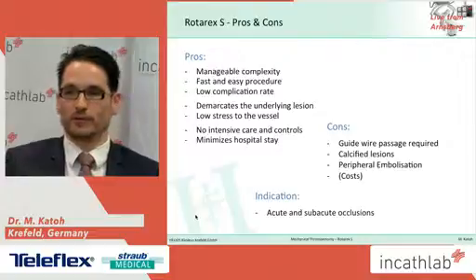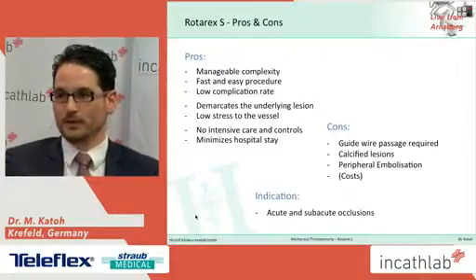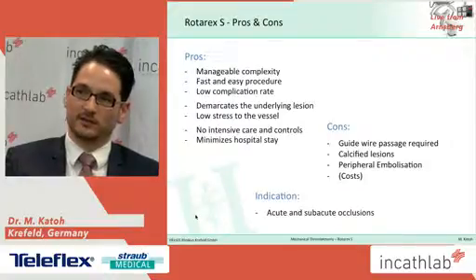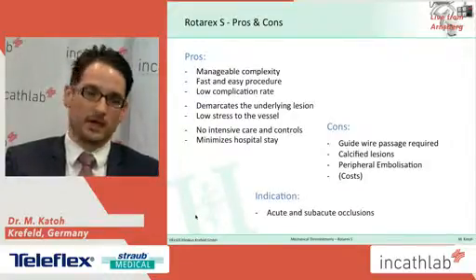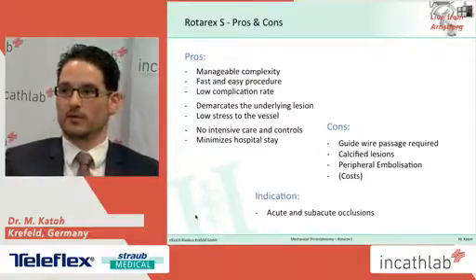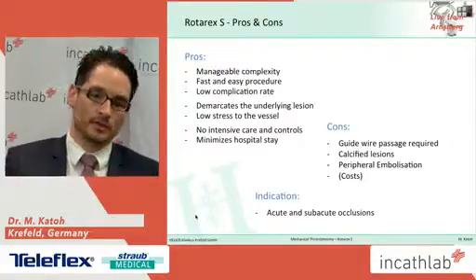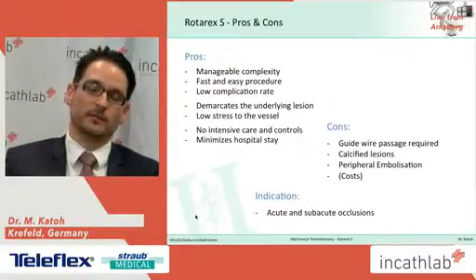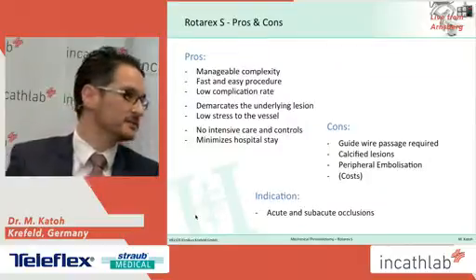And cost is another issue, but at least in Germany I can tell you that it's well represented in the German reimbursement system. So all in all, I must say that the Rotarex S catheter became very handy and popular in our institution, and we use it for acute and subacute occlusions where guide wire passage could be easily performed. Thank you very much.